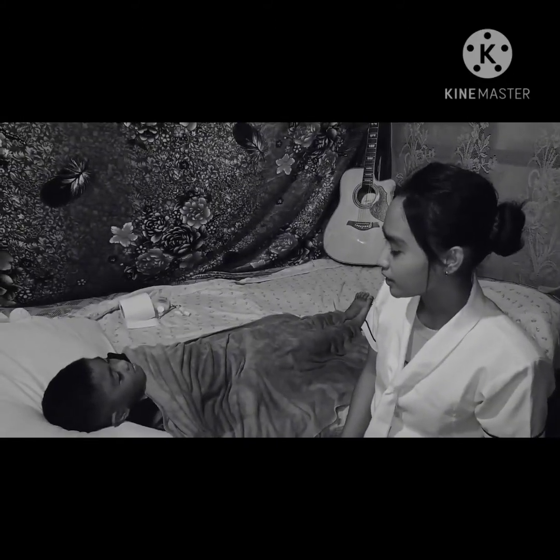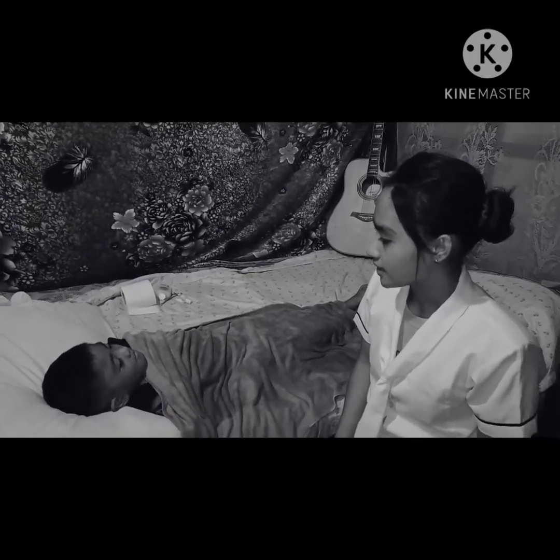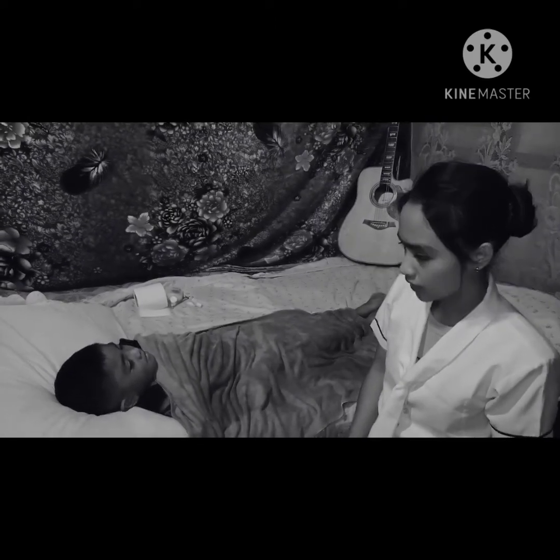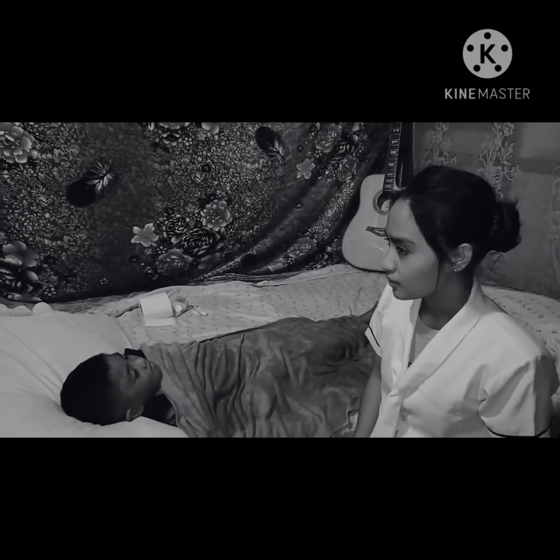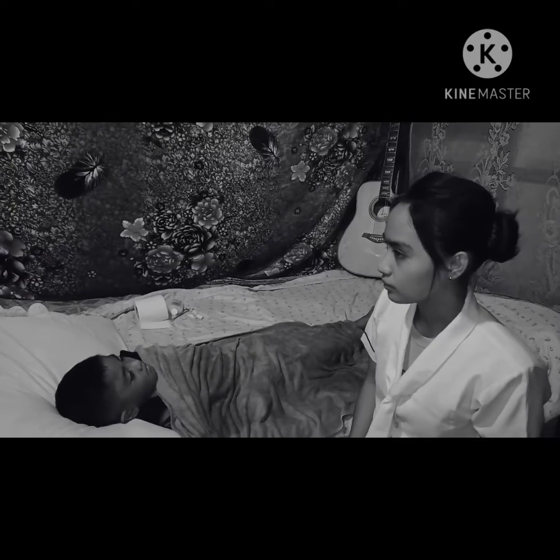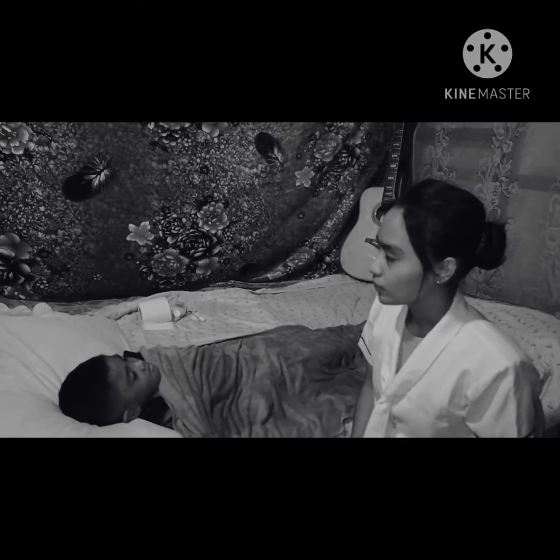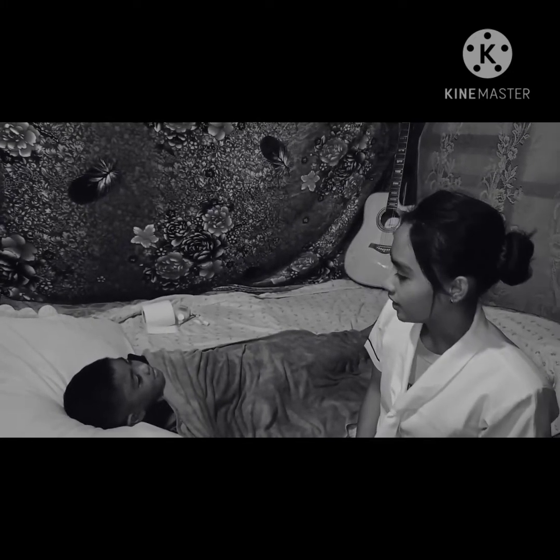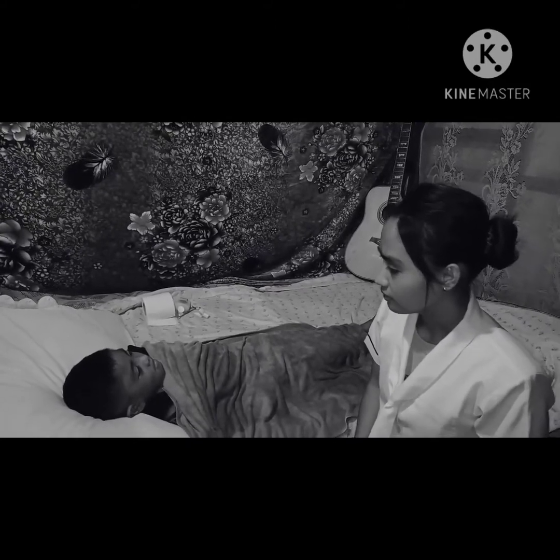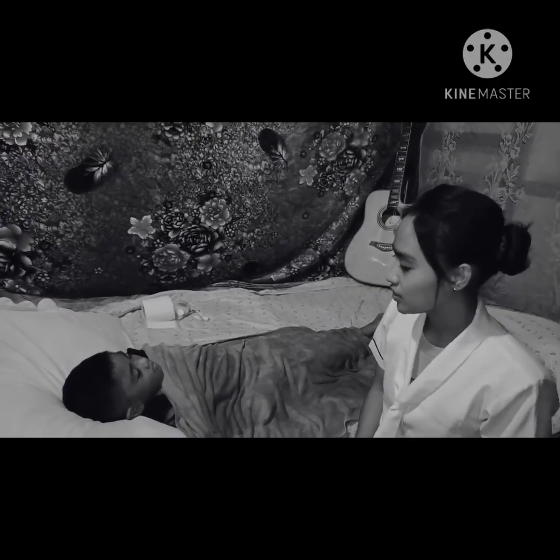Hi, Miss Smith. I'm Nurse Mema and I'm your nurse today. May I know your first and last name? When was your birthday? Okay, perfect. When was the last time that you urinated? Oh, that was 5 hours ago. May I know if you have any allergies to shellfish, latex products, betadine or iodine? Since there is none, I am going to proceed with the procedure.